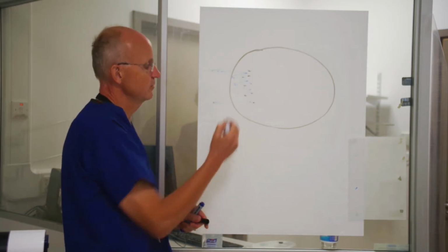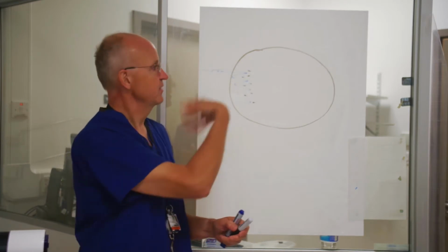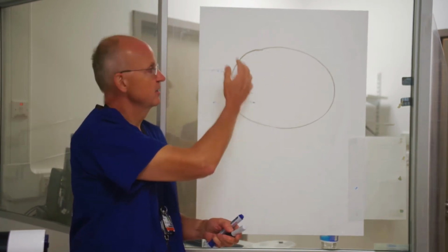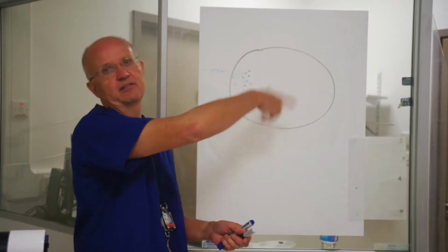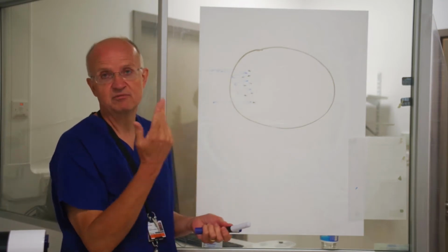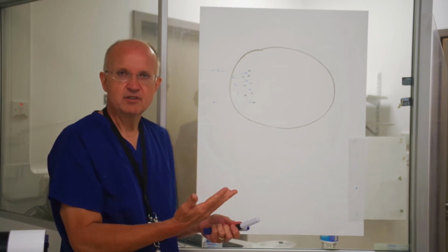Now at the moment, all those electrons are going to do is this filament is going to warm up, the electrons will get excited, they'll emit for a fraction of a second from the filament, and then they'll lose their energy and they'll just drop back in and keep going round and round the circuit, and if we left that on forever, the filament eventually would burn out. So that's not very exciting, is it? That's not going to give us X-rays. What else do we need?